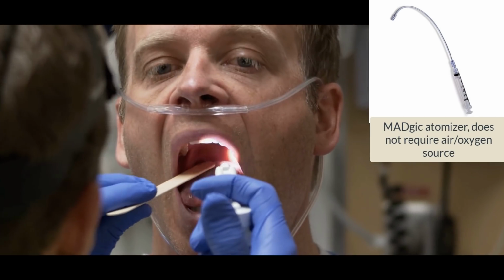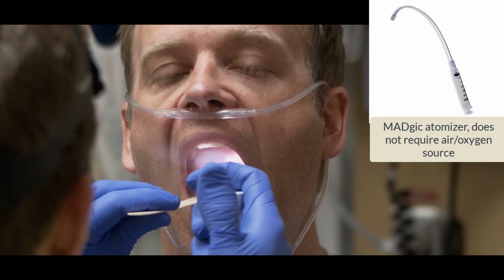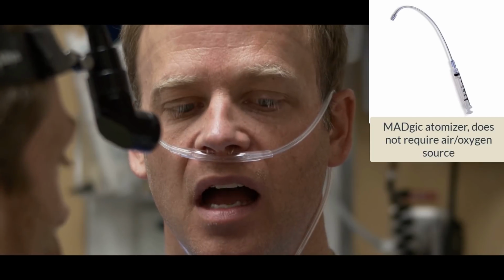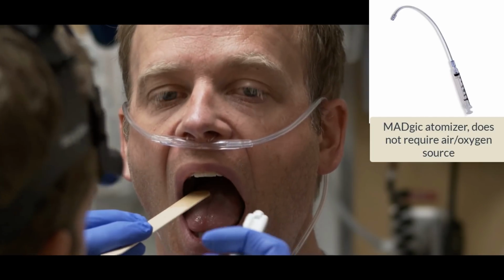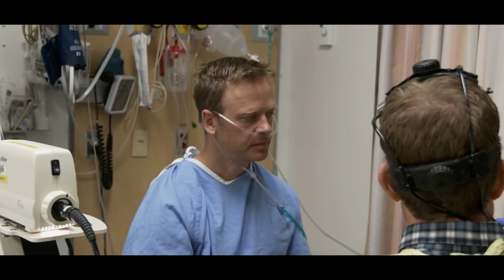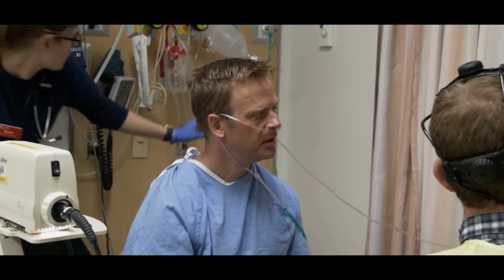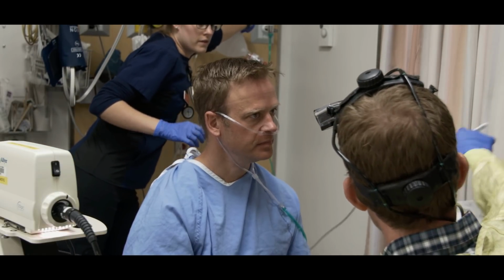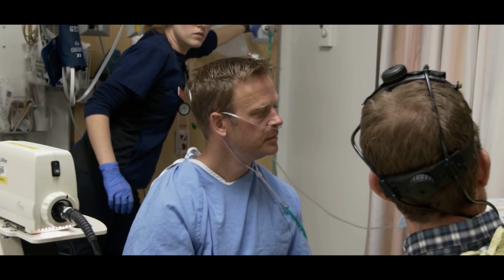Just, is that okay? Yeah. Just a mist coming out of there. Okay. And you can turn that off for now, and we'll use some of that more in a second. Let's stay up on the table.